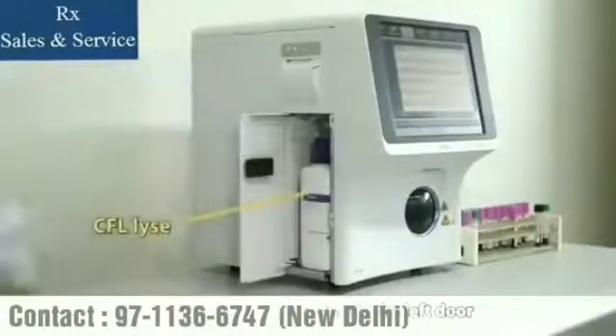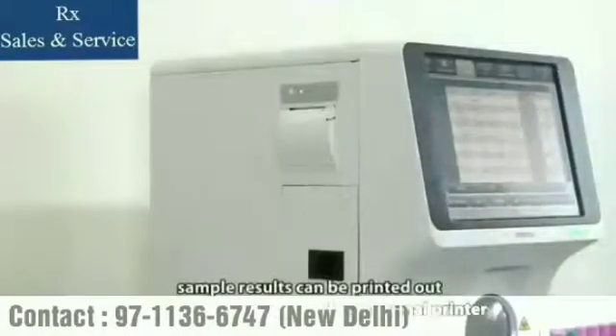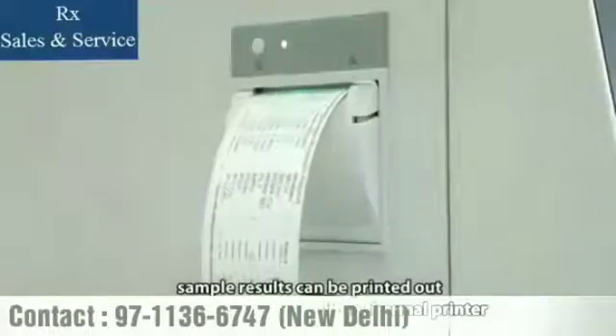The CFL lyse is located inside the left door. What's more, sample results can be printed out automatically by the built-in thermal printer.